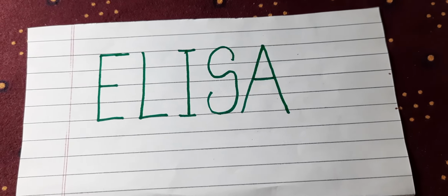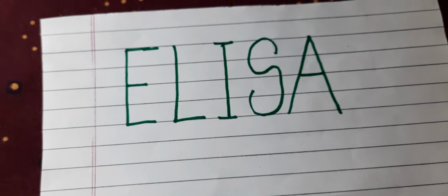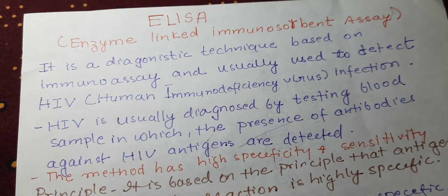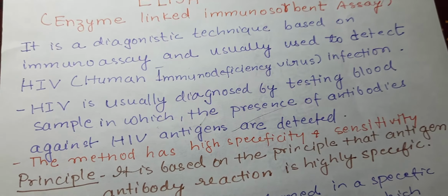Dear student, today we will discuss ELISA, that is enzyme linked immunosorbent assay. Now this is an immunological assay. It is a diagnostic technique based on immunoassay and usually used to detect HIV infection. HIV means human immunodeficiency virus.